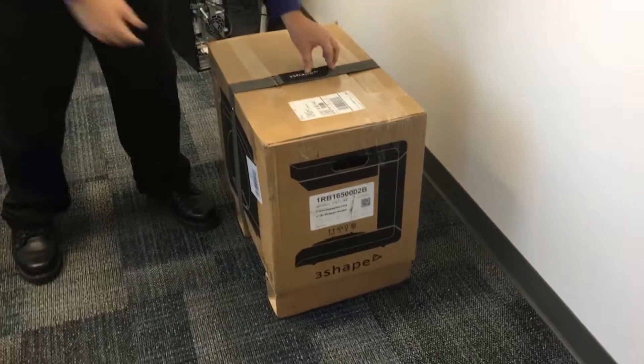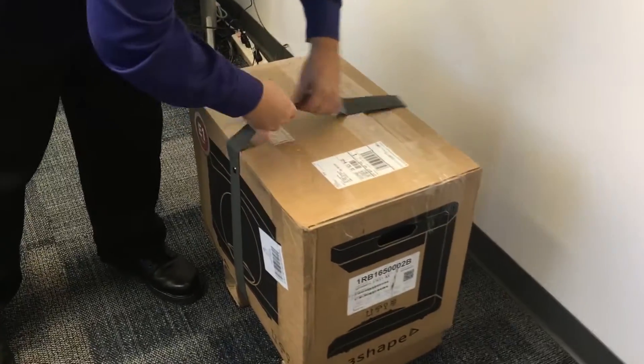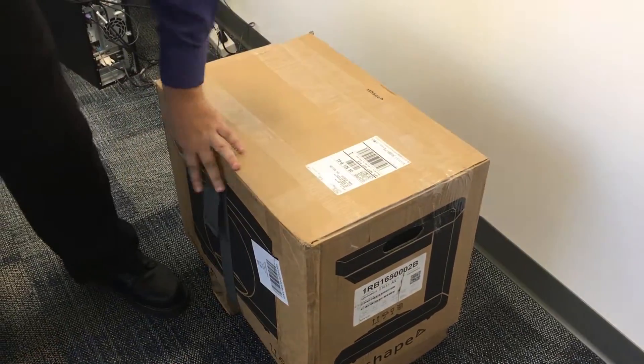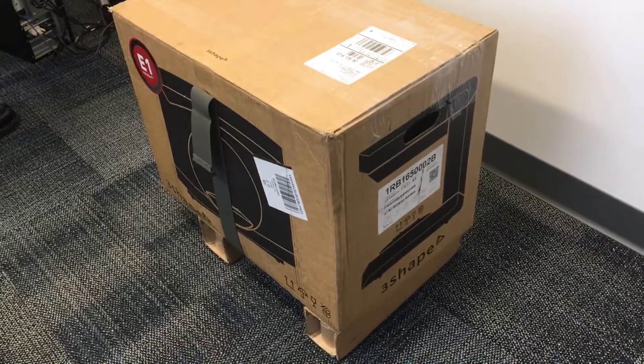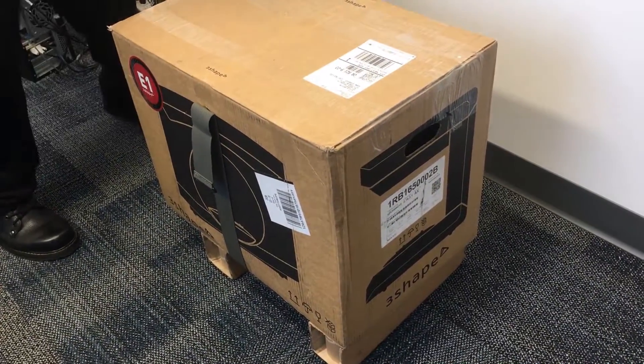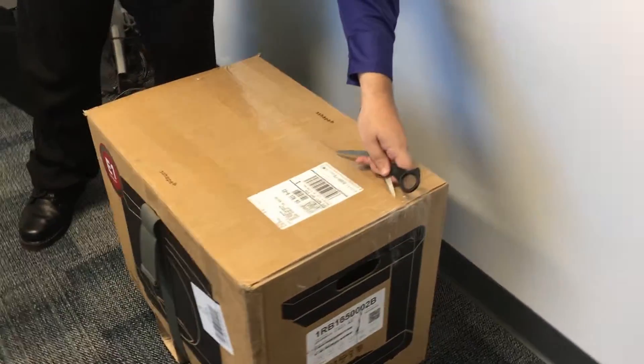The first thing we're going to do is come over here, zip off the Velcro, and open this up. This just stays on. You do want to keep this box in case you need to send your scanner in for any reason, so you don't want to damage it. I'm going to come over here and cut open all the tape.